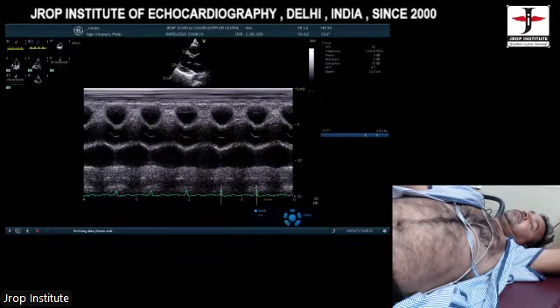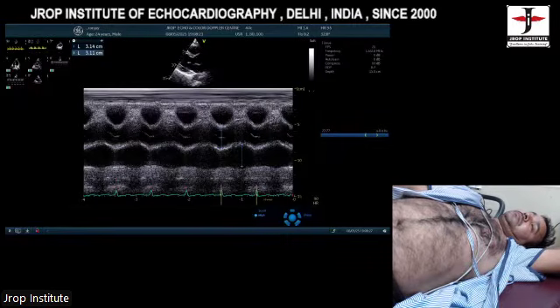And when you get the perfect cut, this is the aorta and this is the LA. Correct? So now you got an aorta LA ratio almost 1:1. Yes, sir. That's how you can do it.